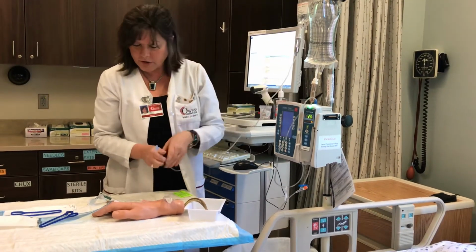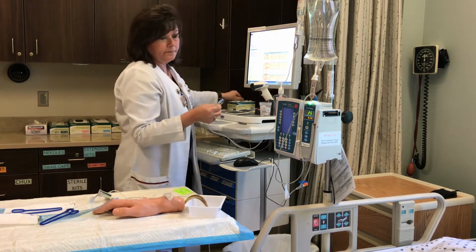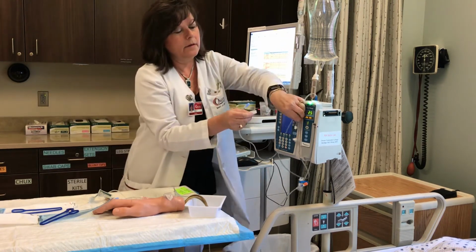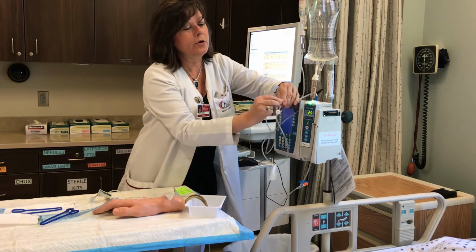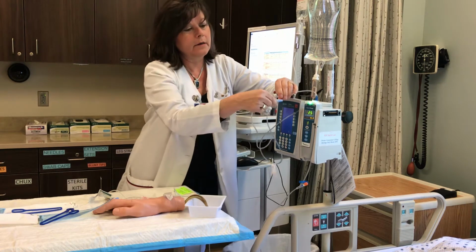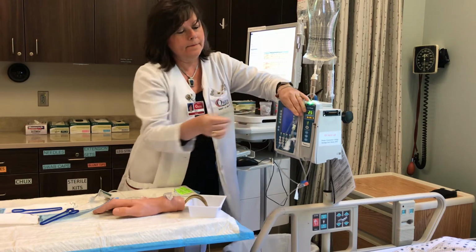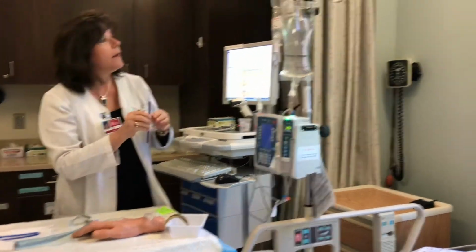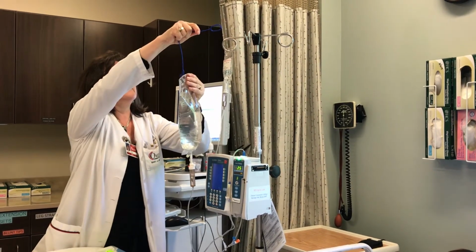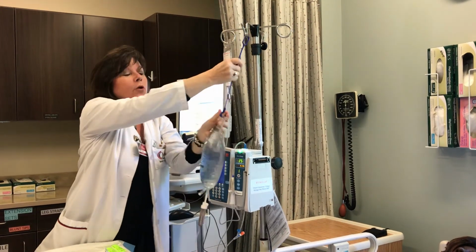And then I'm going to cleanse my connection port. Again, per hospital protocol, for 15 to 30 seconds, and connect my tubing. Lower primary IV fluid. I'm lowering the primary fluid because the pump will infuse the bag that is the highest on the pole.